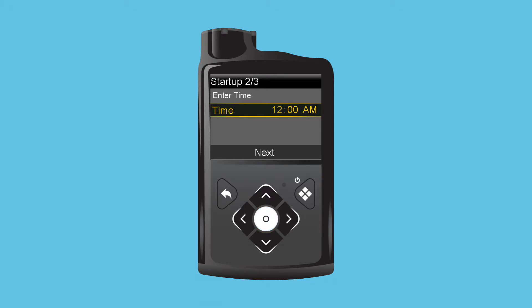Clara will need to set the time. She sees that the hour is flashing, which means it can be changed. She checks her watch and sees it is 1:06 p.m. She presses up to change the hour to 1 and then presses Select. Now the minutes are flashing. She presses up to change the minutes and selects 6. She presses down to p.m. and selects Next.